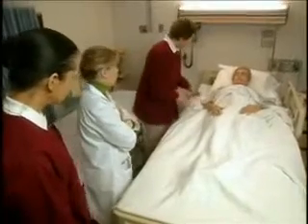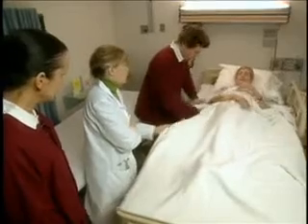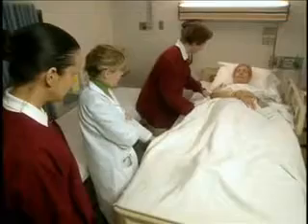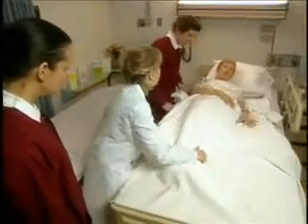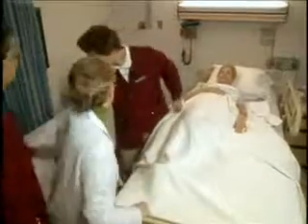Now I'm just going to use the draw sheet to move you to the side of the bed that the stretcher will be on. Okay. 1, 2, 3. Now, place the bath blanket over the patient and remove the top covers from underneath.